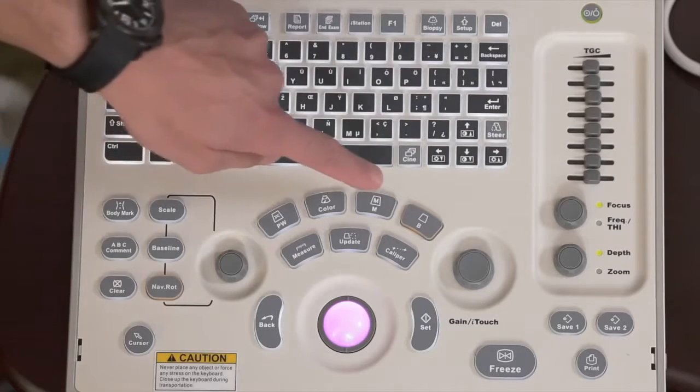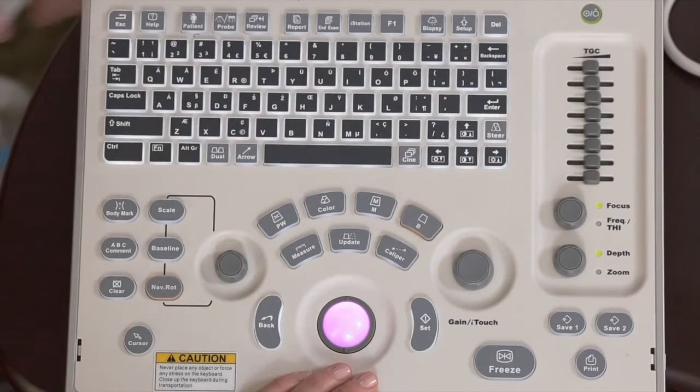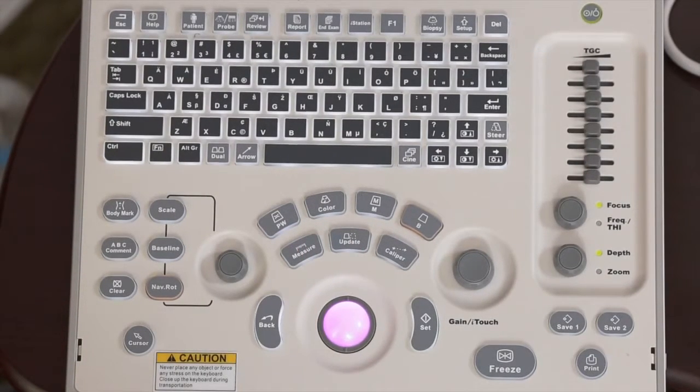Now that you're scanning, Julie, we're going to talk about the modes. You can see that B mode is illuminated in backlit orange, and that's just general basic 2D scanning. Right next to it is M mode, color, and pulse wave Doppler. So you have all your modes right in a row. And let's go ahead and start with M mode first.